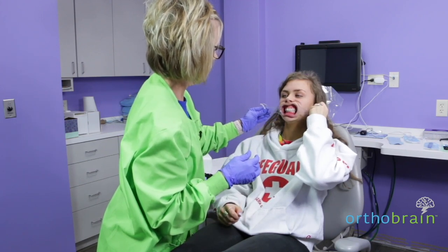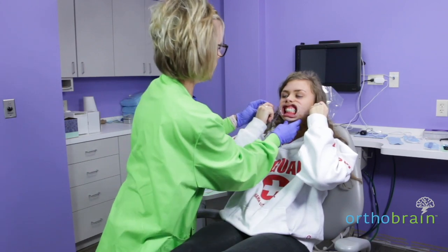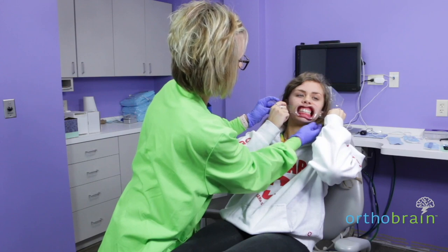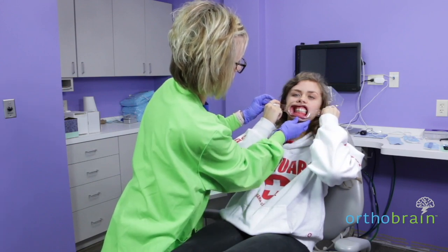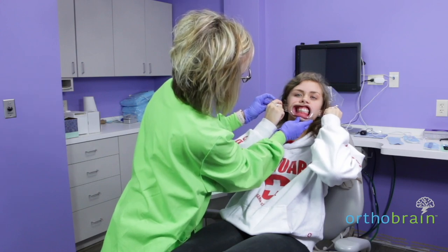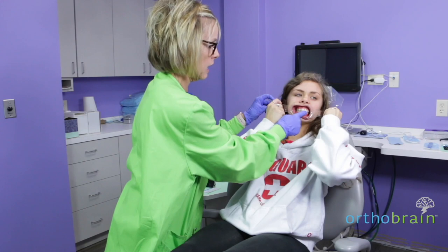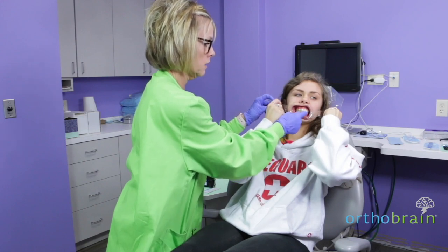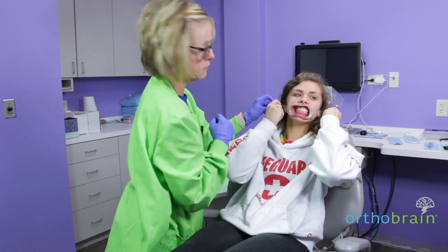Bite down and hold this one for me too. Now I want you to turn your head all the way to the right. I really don't want you to pull on this side very much, but I want you to pull way back on this side. When you take the picture, you want to get half of the other central and at least the first cusp of the first molar.